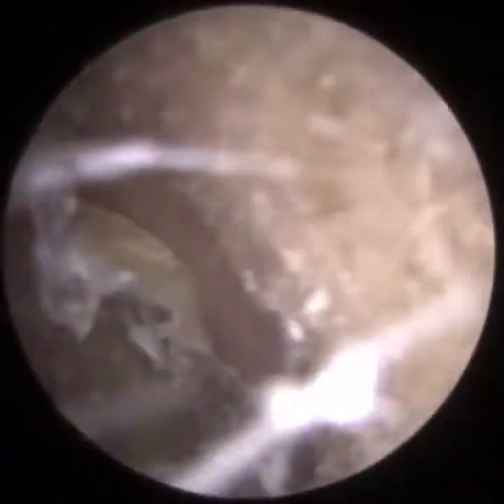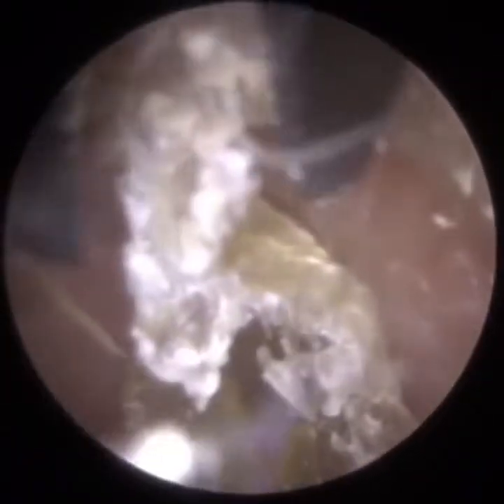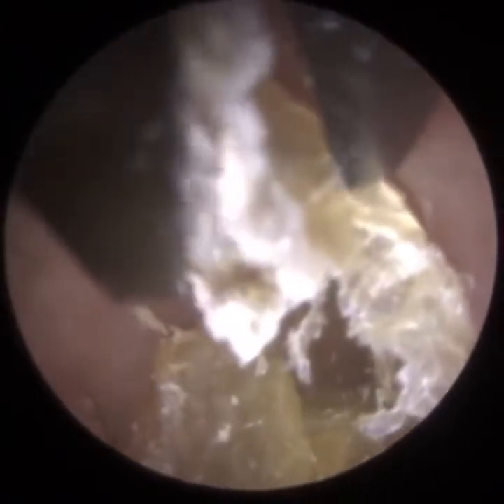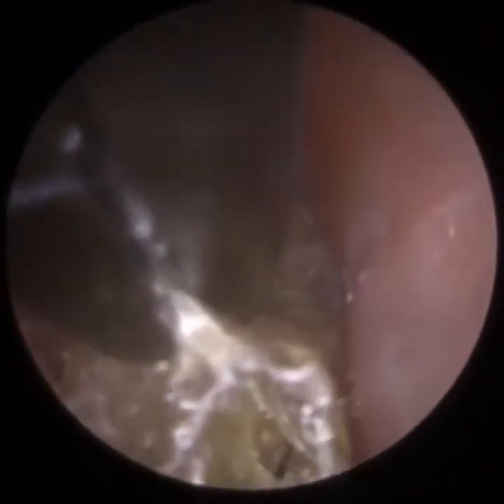Unfortunately, that time, the skin just shredded. It didn't come out in a big cast. So I'm just going back in, maneuvering the forceps forwards, from right to left, trying to move it away from the posterior canal wall. Just in the distance now, you can see it's strongly adhered to the eardrum.